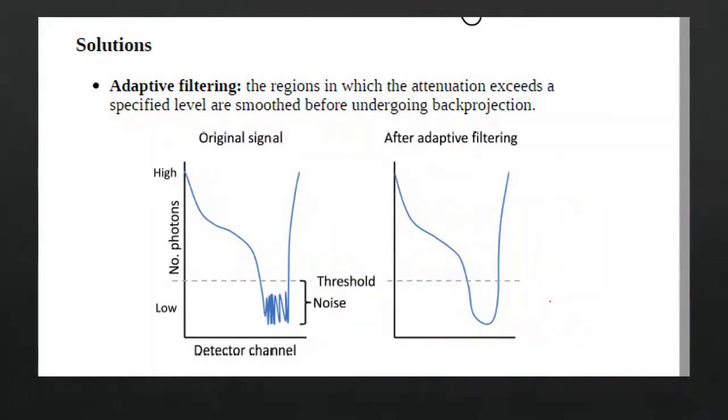Here, it expresses the number of photons coming into a specific region, and you start to see the noise present in this way. After using the adaptive filter, the noise starts to decrease, and a homogeneous value is established for the number of photons, meaning there is a more uniform distribution of photons across your image. In contrast, there were high and low values due to some pixels receiving an appropriate number of photons, while others did not. In this case, it translates to white spots and other areas where there is variation.